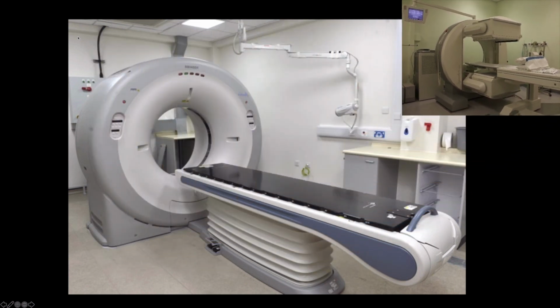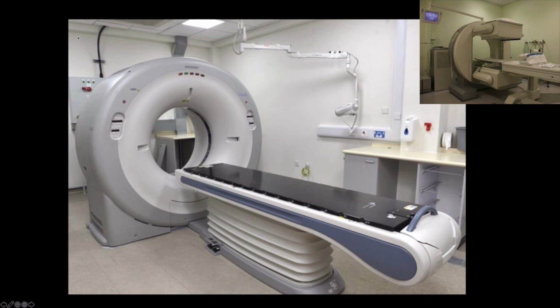But this is a PET CT scan, which is a bit more of a sophisticated piece of equipment. So it is comprised of a PET component, which essentially is a big ring of detectors that surrounds the patient, and it is comprised of a CT component. So the patient can have their PET scan and then immediately have their CT scan on the same camera. So how do we get the PET images?